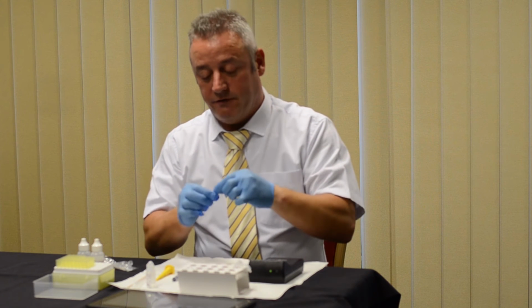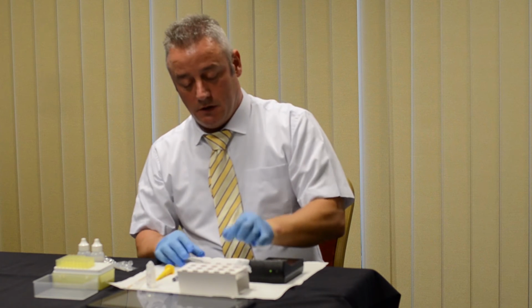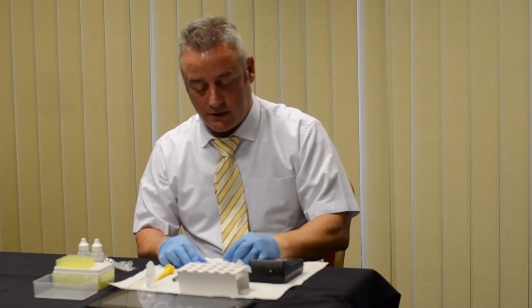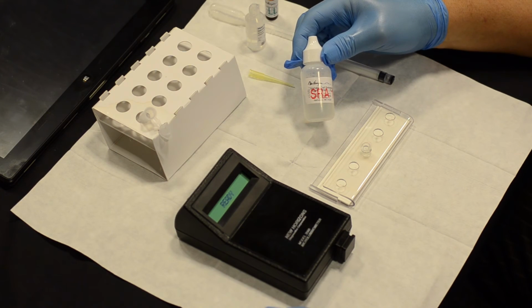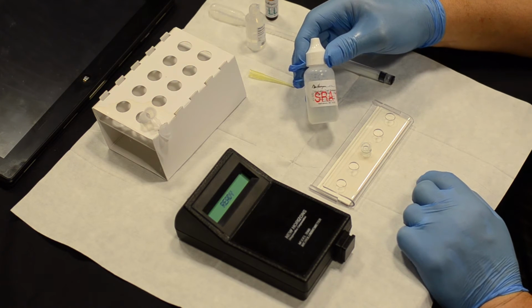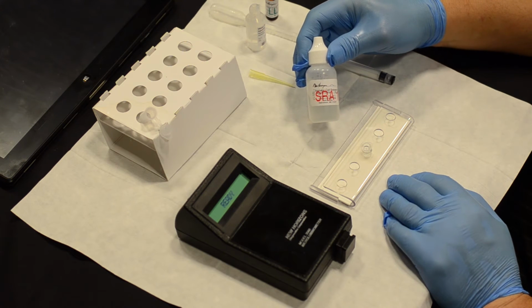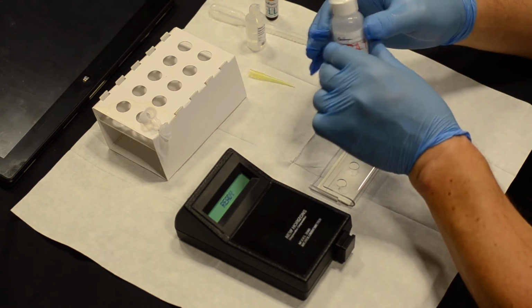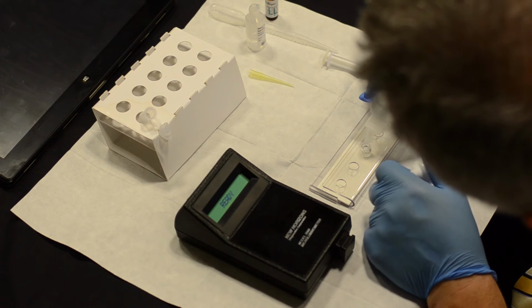Next, I use a Filtravette, which is a small test tube with a filter at the bottom of it. Once I've put the 50 microlitres of contaminated fluid into the Filtravette, I then need to use the somatic releasing agent. What this does is it breaks apart all of the other cells other than bacteria, releasing their ATP. So I need to put 3 drops of that into the Filtravette. 1, 2, 3.